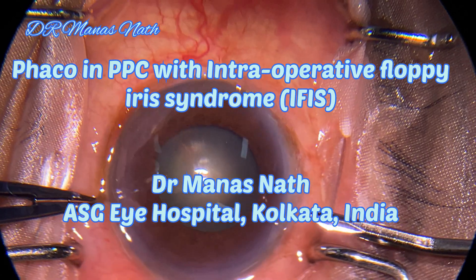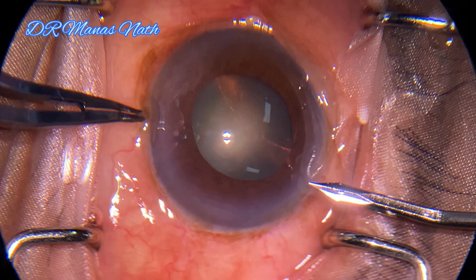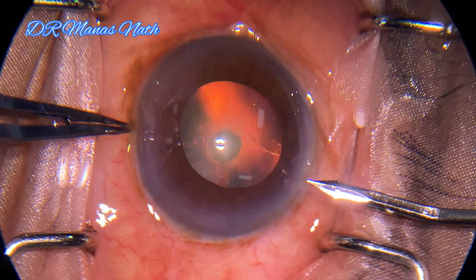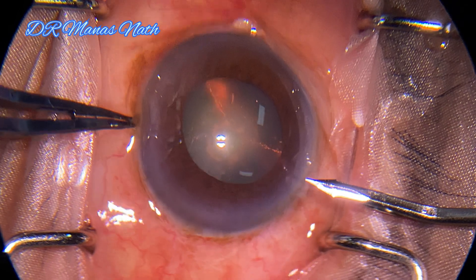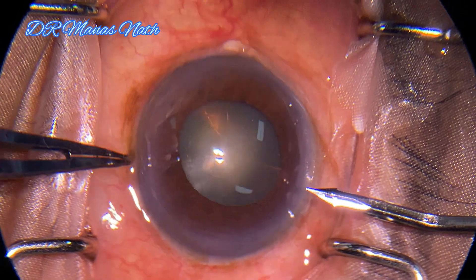Hello everyone. This is a video on phaco in a posterior polar cataract with intraoperative floppy iris syndrome. Although the pupil is mid-dilated, phaco can be done, but I'll show you a few clues which will help in knowing beforehand that the pupil will constrict during surgery.